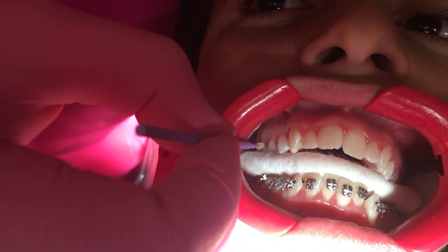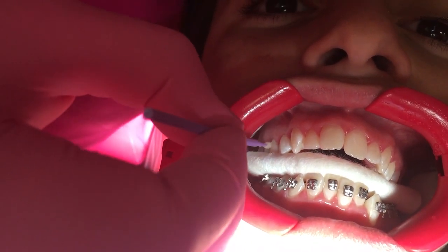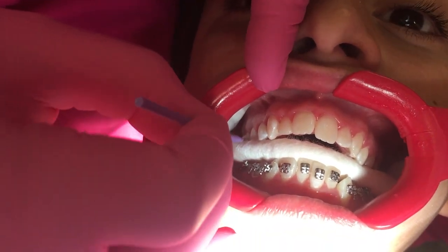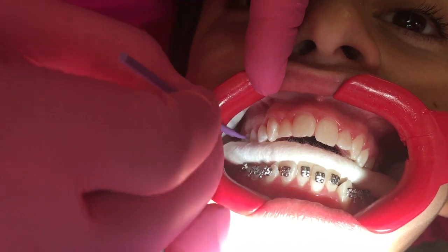And the reason I put the cotton roll this way is if you're painting from gingival, you go, and you see how the excess of the glue that you're putting in there goes to the cotton roll — not to the tongue — so the patient doesn't taste anything.